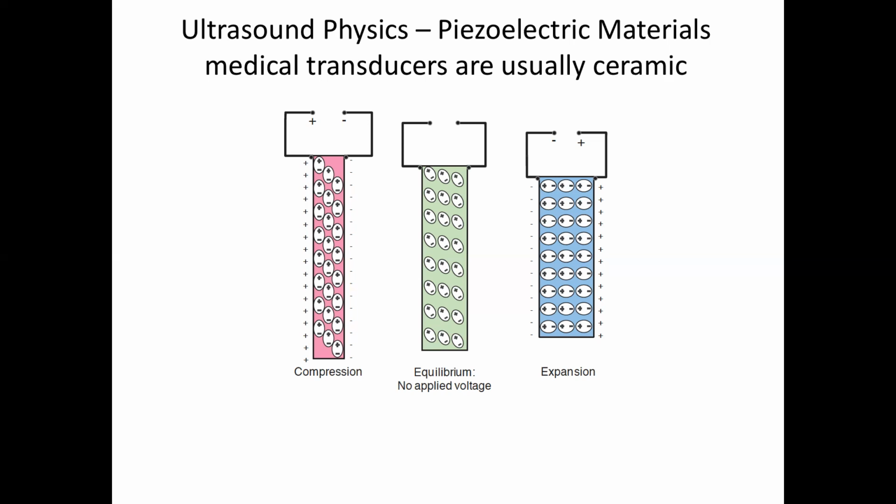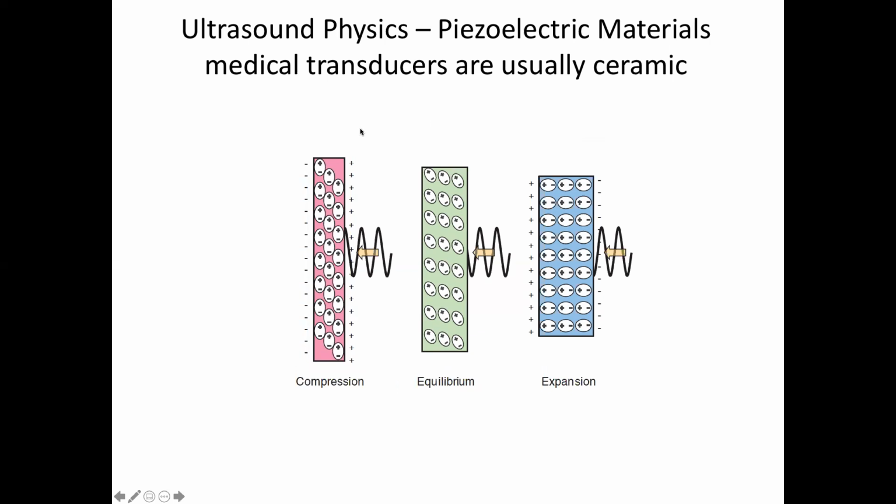And you can essentially just adjust the frequency as you wish to get this going. And so you can see probably the amplitude that you can achieve with these is going to be limited by whatever this throw is, in terms of the strain on this crystal. Well, it's kind of patently obvious what's going on here, right? This thing is getting thicker and thinner and thicker and thinner, and therefore the pressure wave is coming off the front of the device.